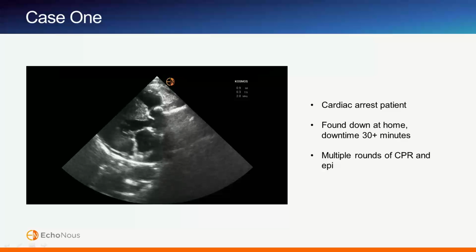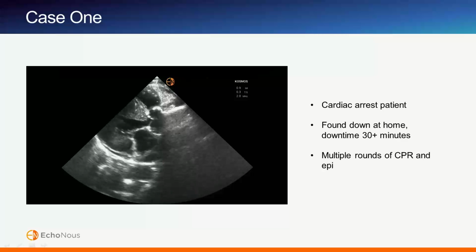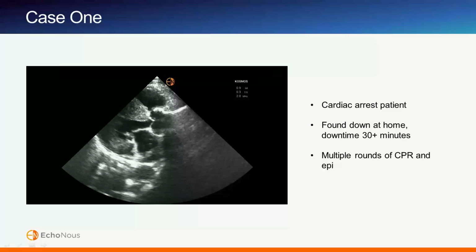So I like ultrasound here because it allows you to feel comfortable, or just gives you another data point when it comes to terminating resuscitation. And it shows the entire room. I like to turn and show my nurses and PAs and whoever else is in the room and say, look, would you agree that this is not a perfusable squeeze? Or we talk about it if there's another resident in the room, just so everyone's kind of involved in that decision making. I do the same exact thing.